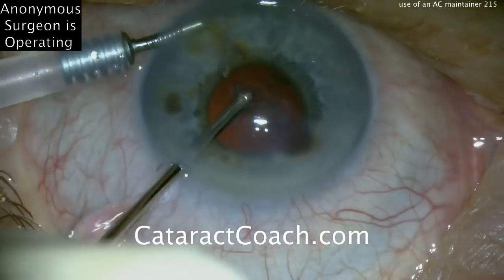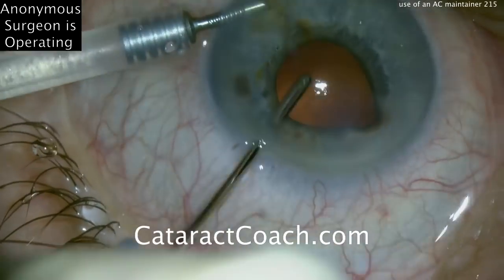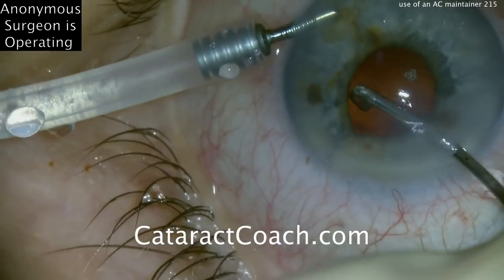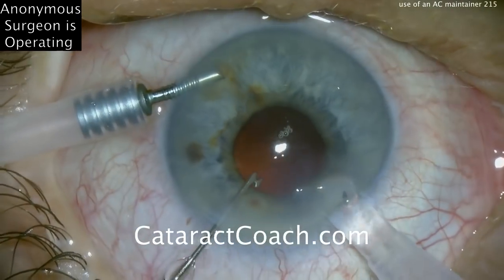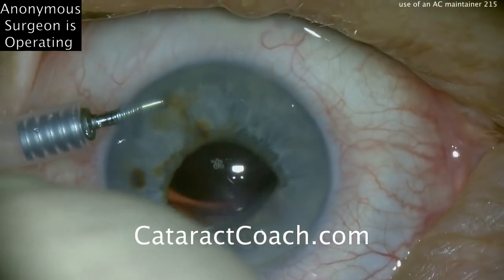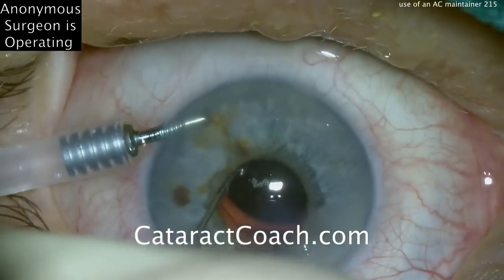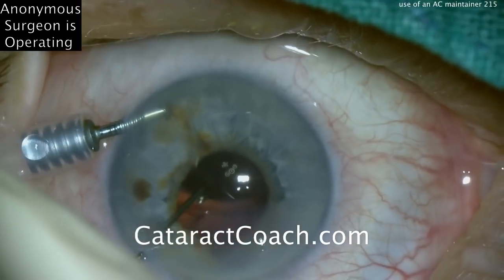Cleaning up everything here — that looks great. Now time for IOL insertion. You can fill the capsule bag with viscoelastic as I normally do, which makes it very easy to insert the IOL, but viscoelastic is not inexpensive. In some situations like this, you can just use an anterior chamber maintainer to keep the eye inflated as you put in the IOL — which is what we're doing right there. The lens looks good going in the capsule bag. Now dialing in that last haptic. I'd recommend using the second instrument to lift up the iris to ensure the capsule bag is overlapping the optic for 360 degrees — you don't want one haptic stuck in the sulcus.